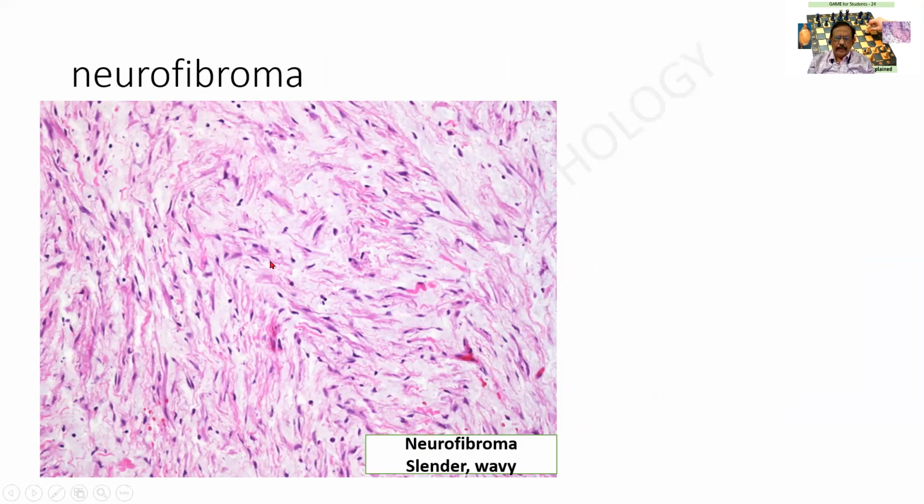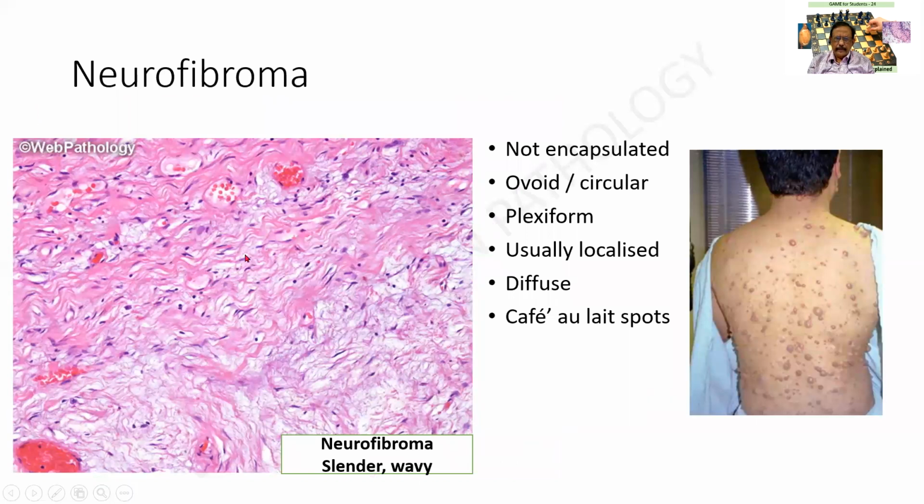This is a slide for you people. In this, I'm finding slender cells and slender nuclei. Look at this one, very delicate fibrils and then a nucleus. And what I'm seeing as colorless is a stroma. Edematous spindle-shaped cells, wavy nuclei, slender wavy nuclei. If you are not impressed with it, see this picture. See this one. So obviously one thing that is striking me is the wavy nature of the lesion. And it is not composed of stout cells. They are very delicate and elongated tapering nuclei.